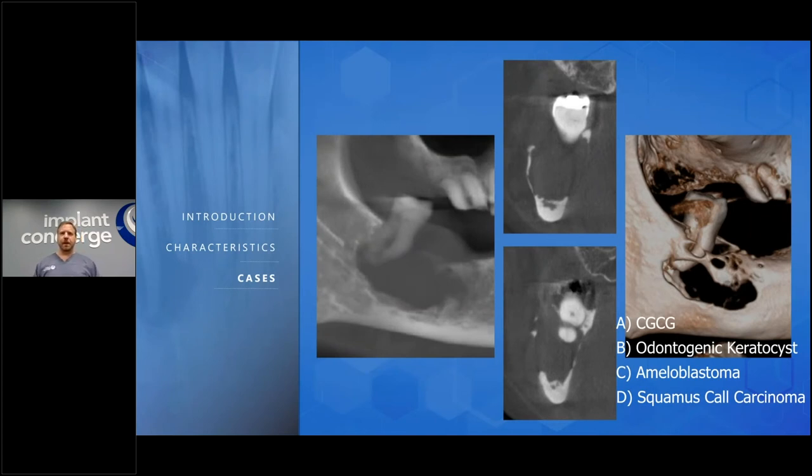All right. I had this in the presentation last week. Let's see if people remember. I don't have such perfect, clear examples of this. Most of the time they're a little bit more ambiguous, but this one screamed the diagnosis. Here you have a small amount of expansion, a lot of bone destruction, and a soft tissue component just mesial to the 32. You can see the bone just being eaten away. The mandibular canal, you can't even trace it.